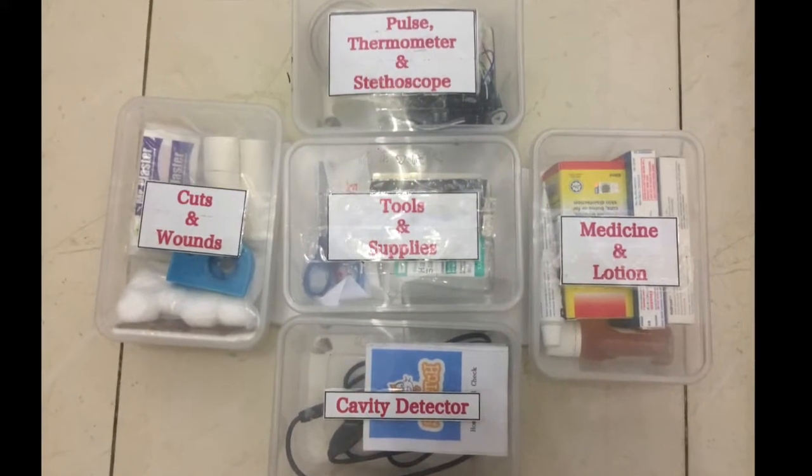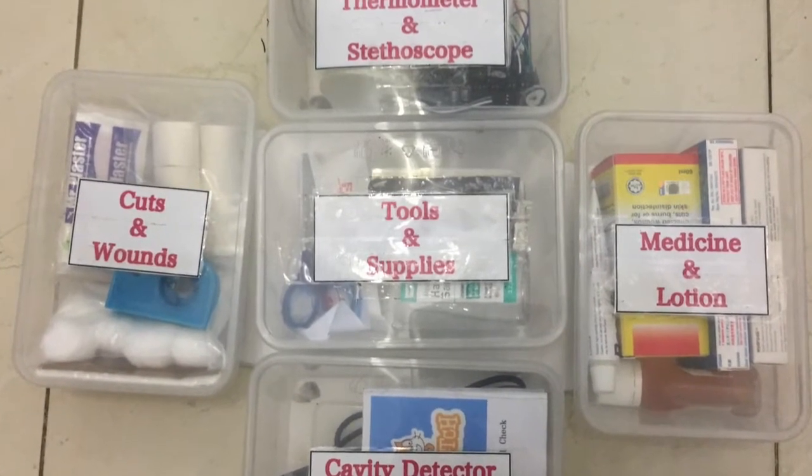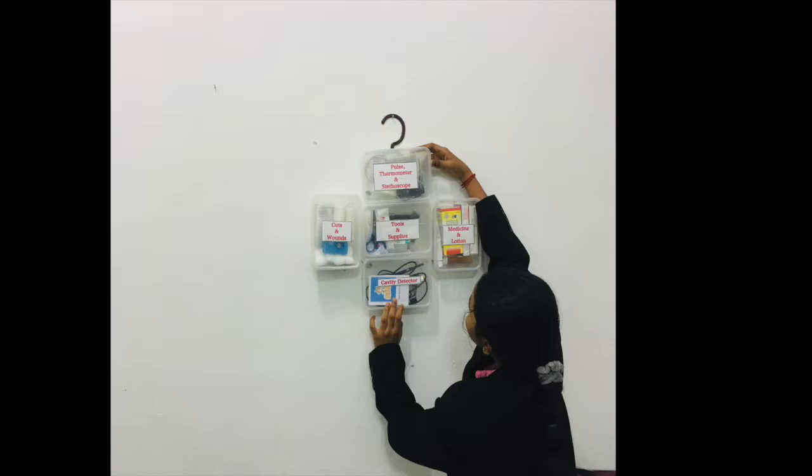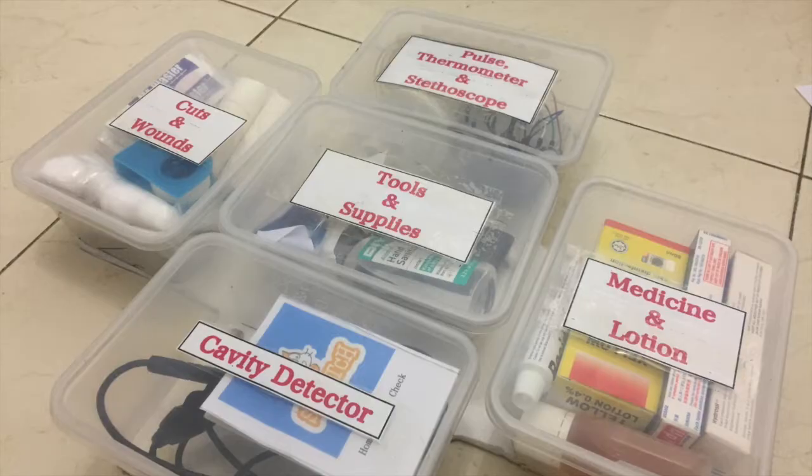This is my product. It is Quick Home Medicare. It has 5 compartments: for pulse rate reader, thermometer, stethoscope, for cuts and wounds, for cavity detector, for medicine and antiseptic lotion, for tools and supplies.